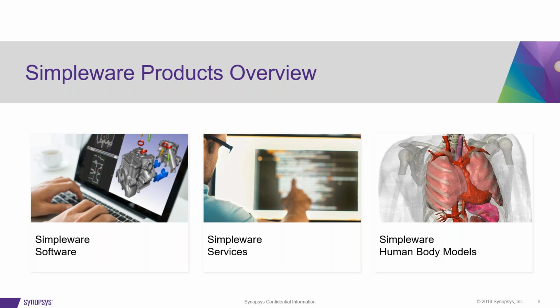In addition to this, we also offer services. This can be in the form of software customization and expansion of the software through development of bespoke plugins and scripts, or it can be simply in data processing. If you don't want to purchase the software and process your data yourself, we can do it for you as a service. And then finally, the solution of discussion for today, the Simpleware human body models.